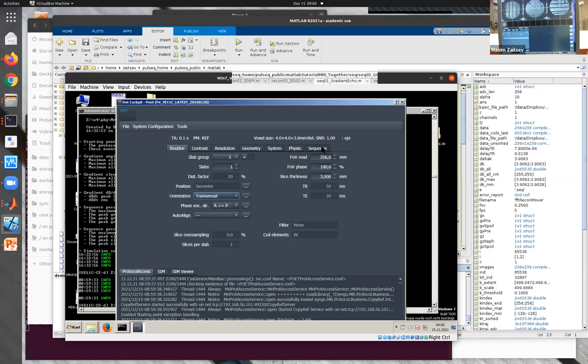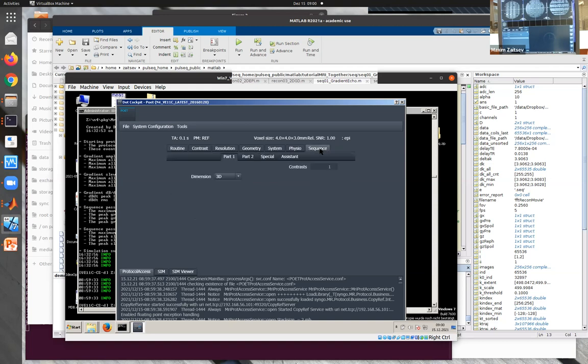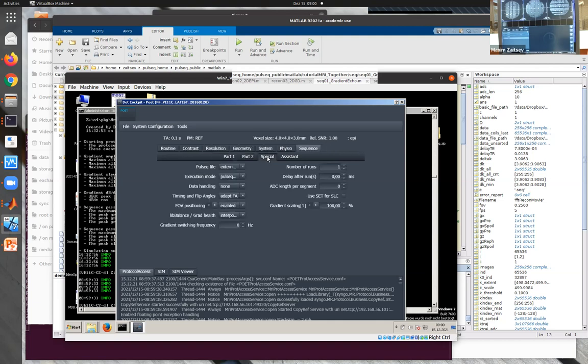But basically, it's only the orientation which can be changed. We give the signals as a source code. If somebody manages to make all these parameters invisible, please do that. That will not confuse people. One thing which is possible, and this is really a new feature of the new interpreter, which is available since a few weeks, is the selection of this drop-down list.